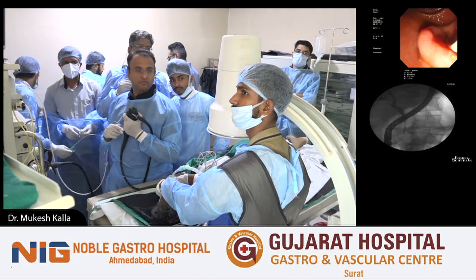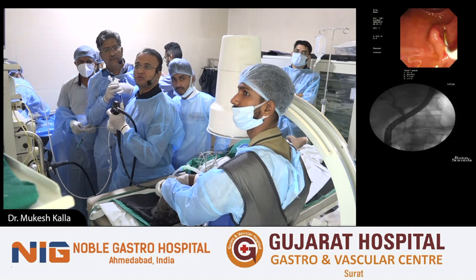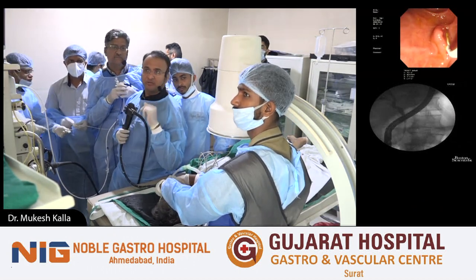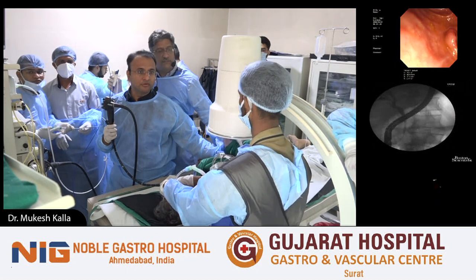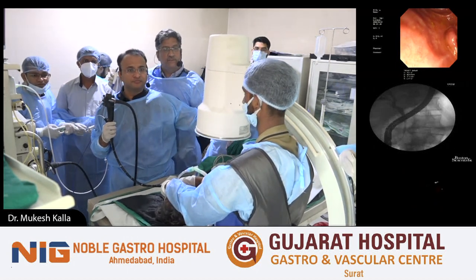But as Dr. Mahesh Goenka very elaborately said, there are two situations where I would not venture. One is large stacked-up stones, or even sometimes stones in a difficult location, what he discussed. But otherwise, first is endoscopy.